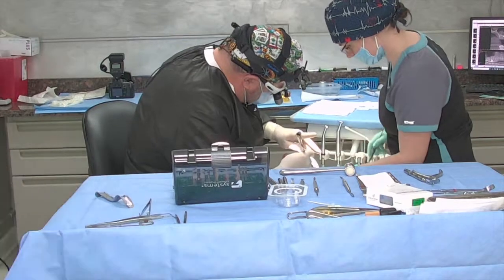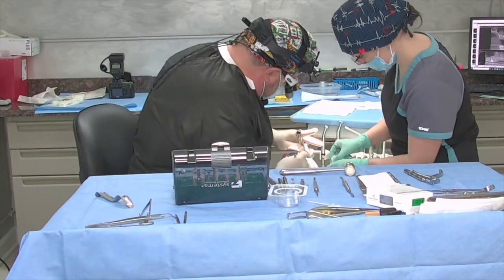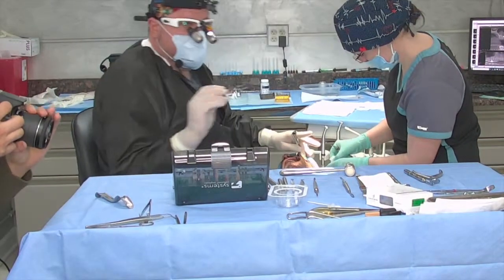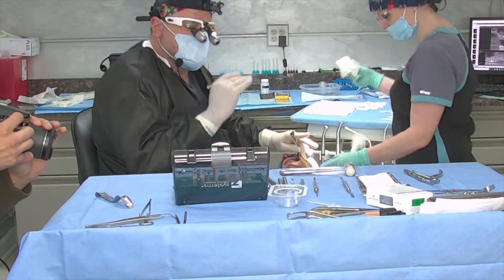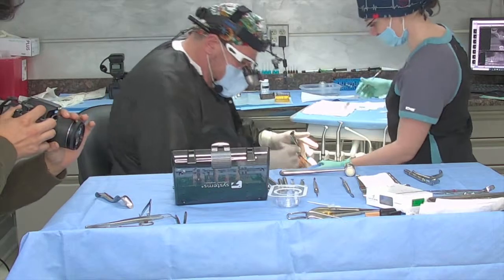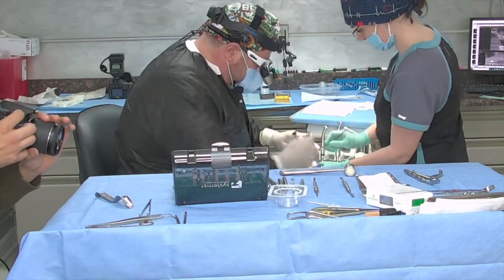Oh, this is that little pouch that we made before. Now, this is purely cosmetic. We've got bone on the facial of the implant. So I'm doing this just to get rid of some of the dimple that we have here on the facial aspect of the implant, okay?